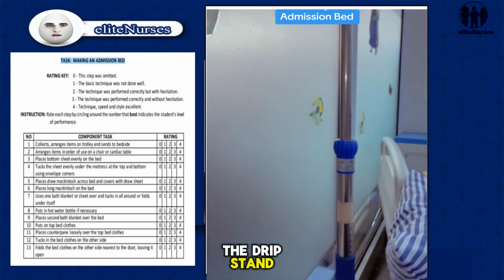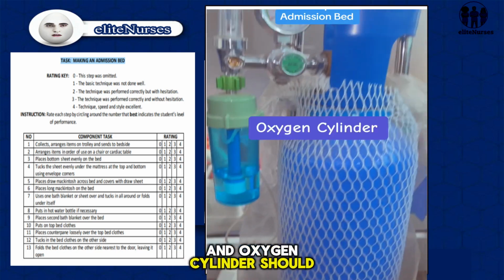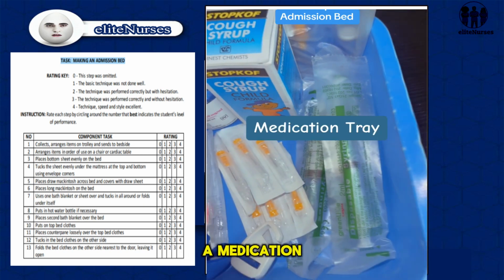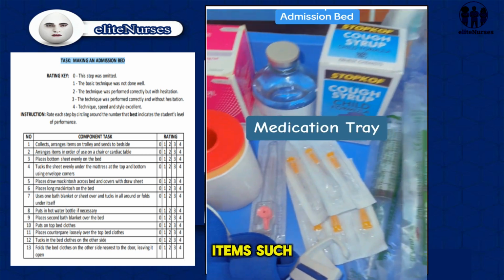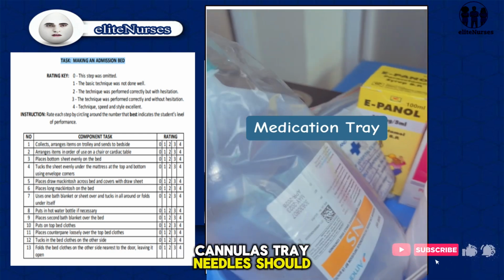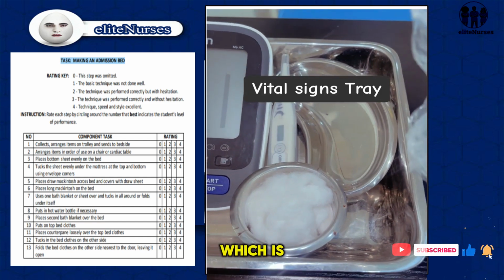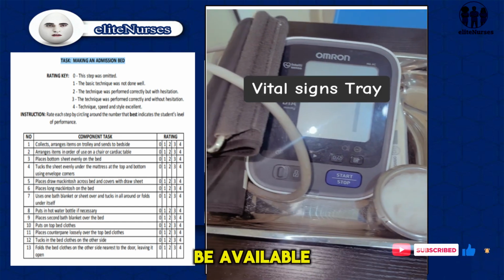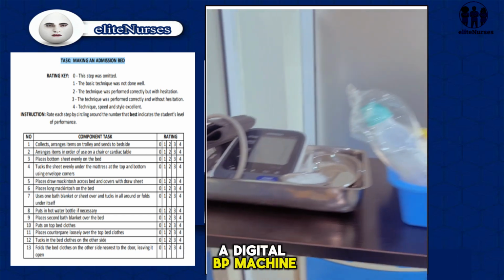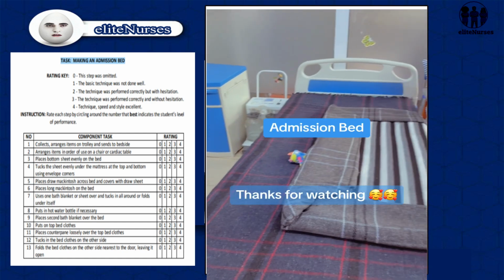The drip stand, suction machine, and oxygen cylinder should be available at the bedside. A medication tray containing items such as IV infusions, medications, cannulas, and needles should be available. The second tray, which is the vital signs tray, should also be available, containing items such as a digital BP machine, the thermometer, and the rest. Admission bed.